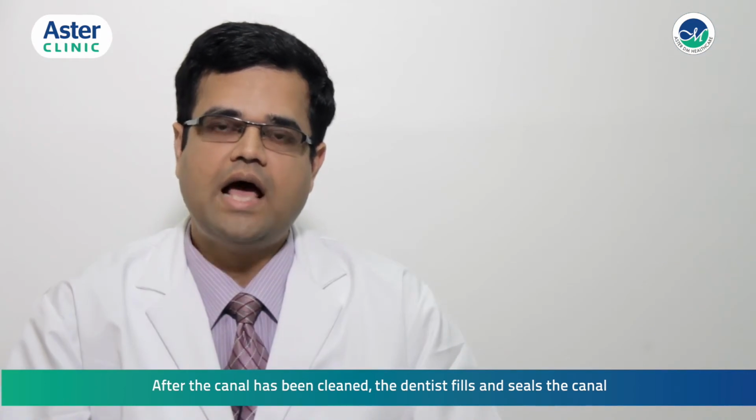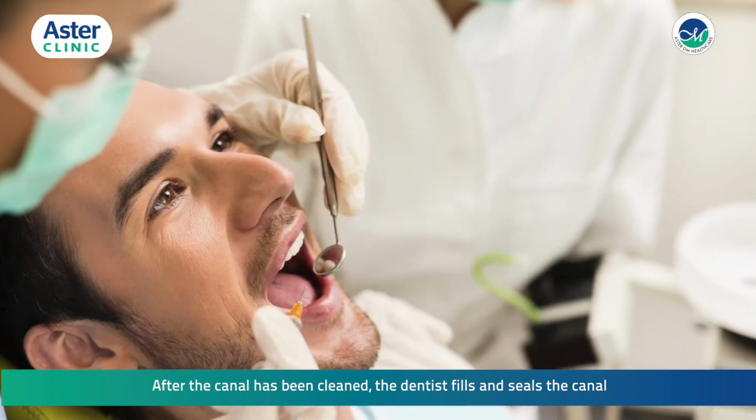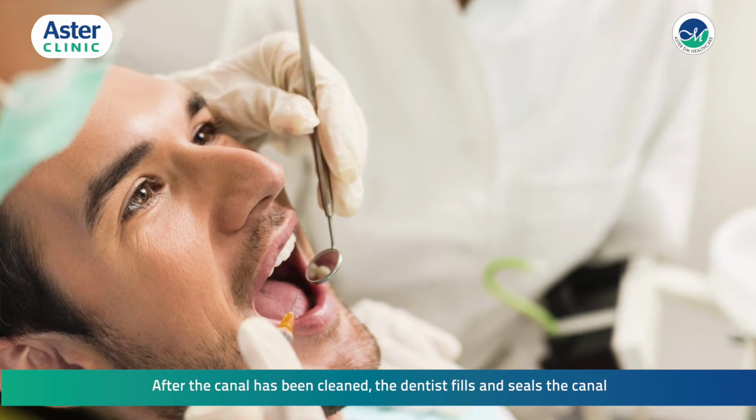After the canal has been cleaned, the dentist fills and seals the canal. The opening of the tooth is then sealed with either a temporary or permanent filling.